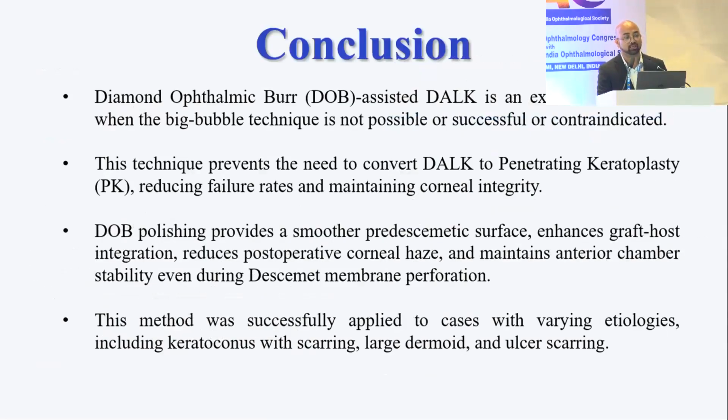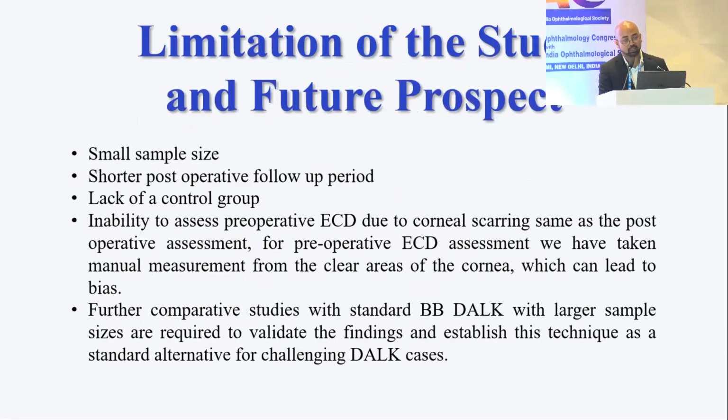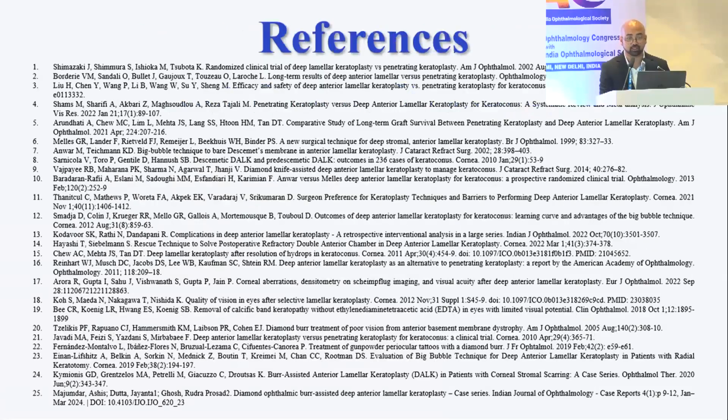As a conclusion, I can say that diamond ophthalmic bar DALK is an excellent alternative in critical cases where big bubble DALK cannot always be performed successfully. The limitations of the study are a small sample size and shorter post-operative period; a longer post-operative follow-up should be done. These are my references.